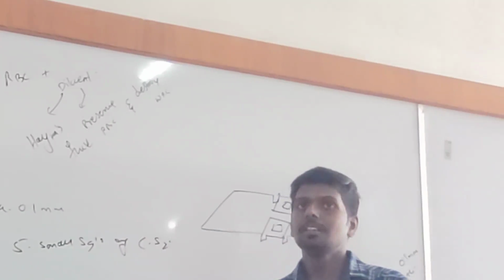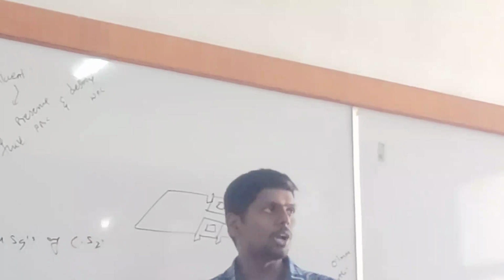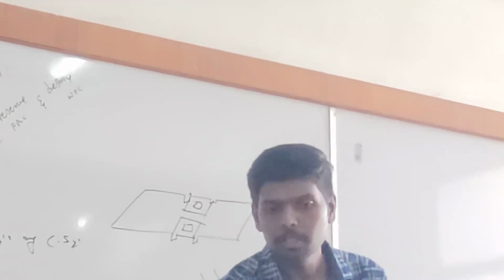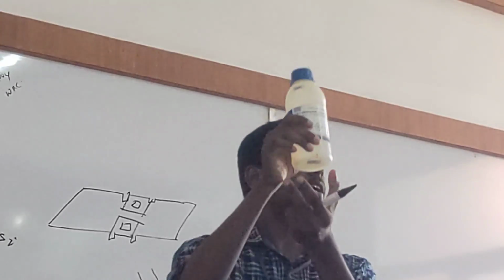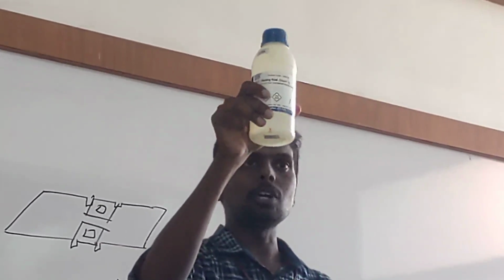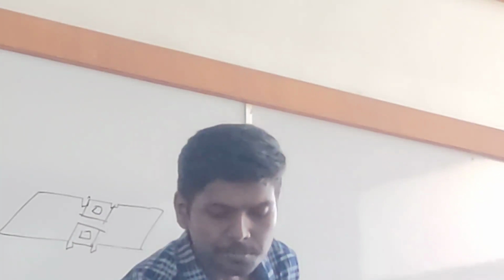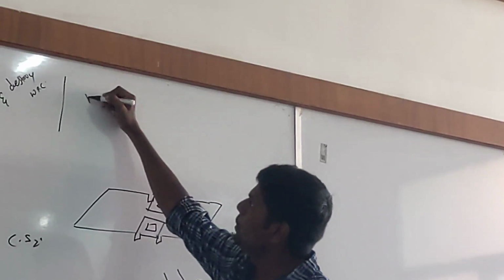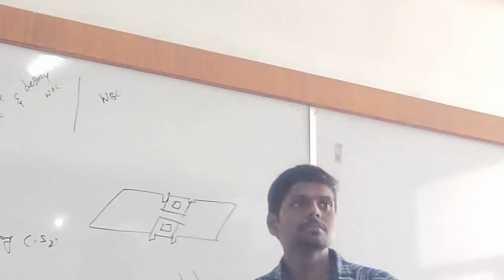Clear? RBC diluting fluid is called as Hayem's fluid. Okay. So this is Hayem's fluid. I'm writing here itself, WBC diluting fluid.